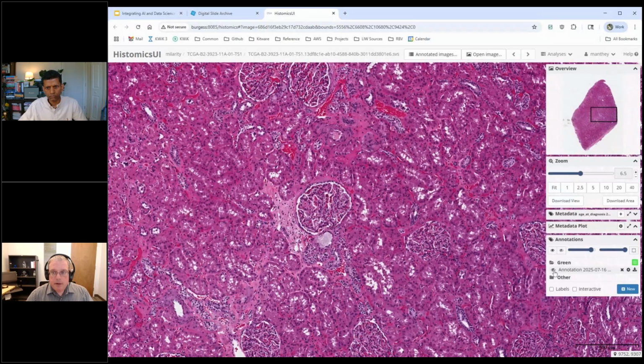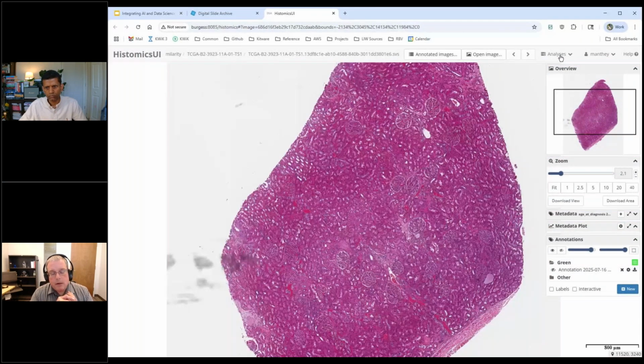And we have a tab here called analyses. And analyses are any of these additional processing plugins that get added to our system. And you might have just one or two, or we've seen customers who have literally hundreds of them as they develop things. And they might be different versions. They might be different projects to try things out.